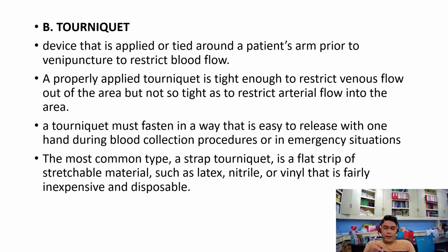Now regarding the tourniquet, the restriction of venous flow distends, or inflates, the vein.